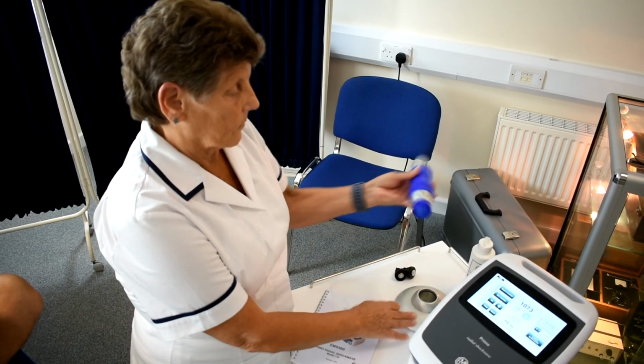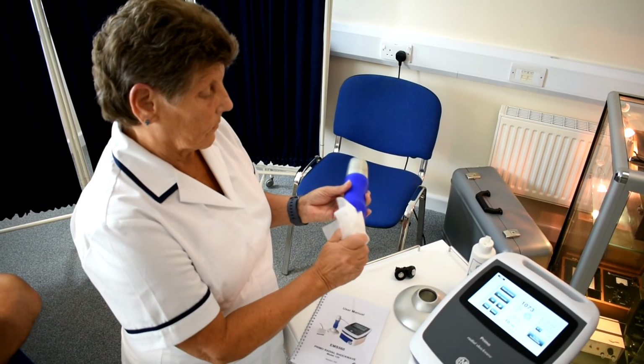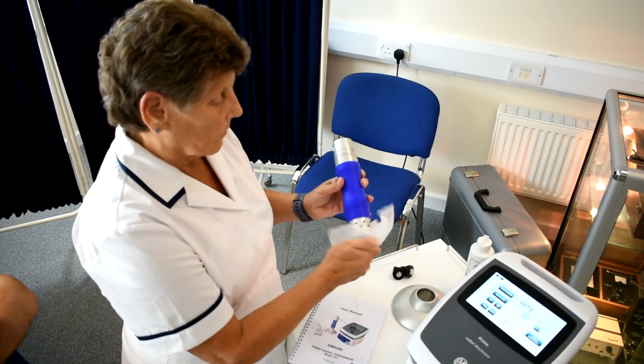At the end of the treatment, which would normally only take a few minutes, just clean or replace the tip and membrane, ready for the next patient.